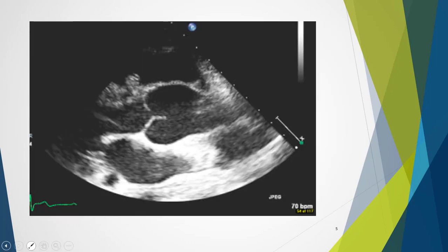In this example of Marfan's disease, we see the typical onion bulb look to the aortic root — large and bulbous here — with a significant dimension, and then tapering down to the ascending aorta size.